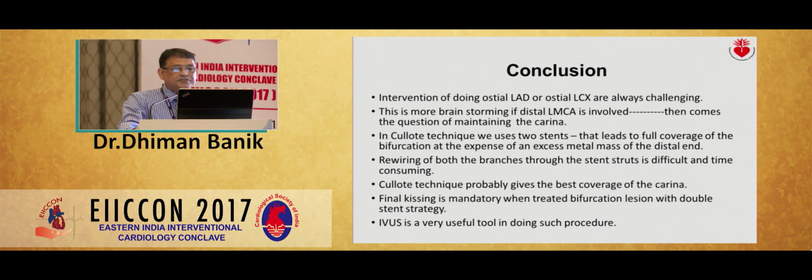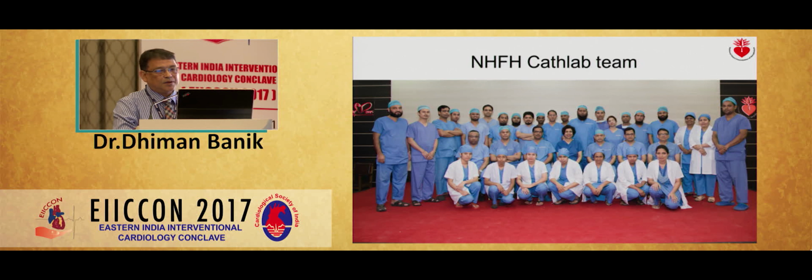Rewiring of both the branches through the stent struts is difficult and time consuming. Culotte technique probably gives the best coverage of the carina. Final kissing is mandatory when treating a bifurcation lesion with a double stent strategy. IVUS is a very good tool in doing such a case. This is our cath lab team.